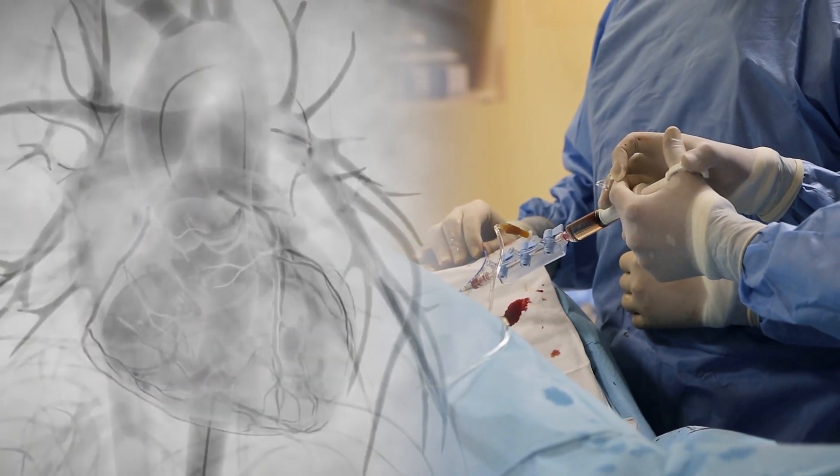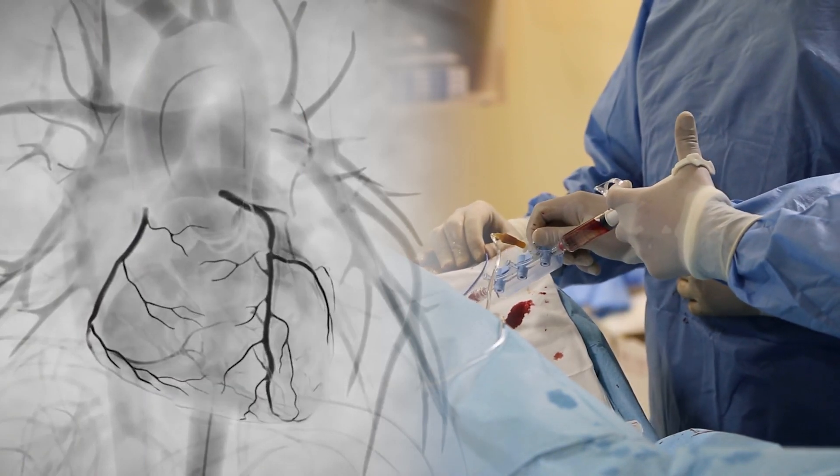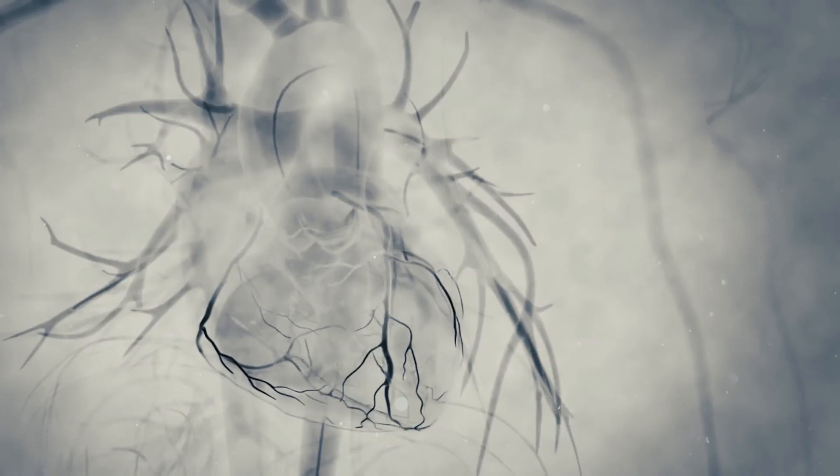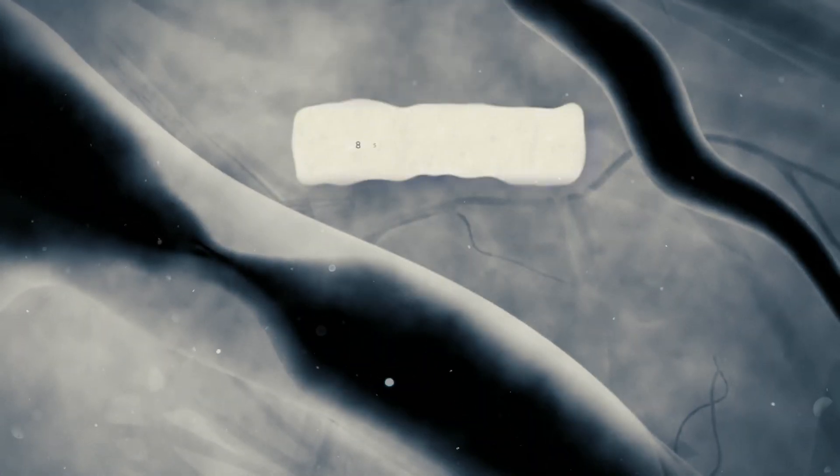Once the catheter is in place, your doctor will inject a liquid dye through the catheter. The dye makes the blood flowing inside the blood vessels visible on an x-ray and shows any narrowed or blocked areas in the blood vessels.